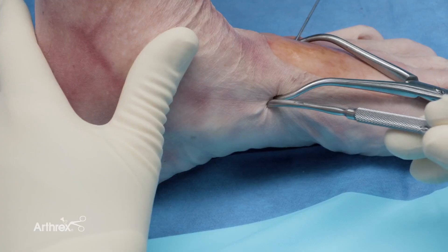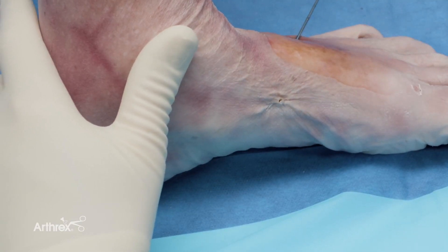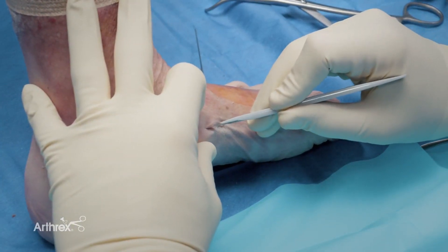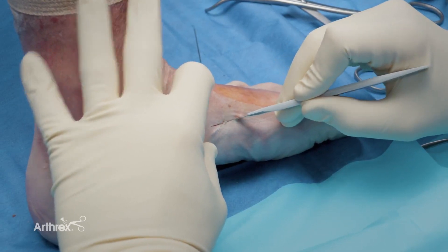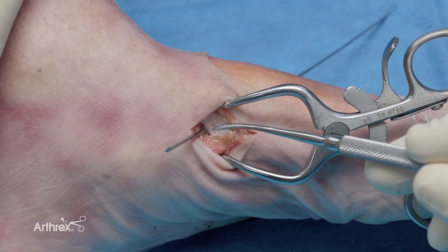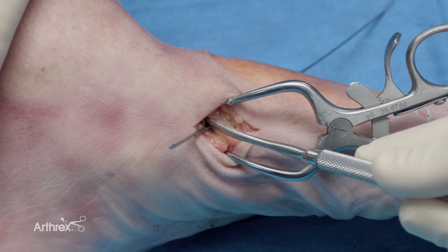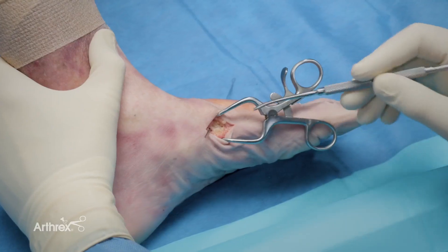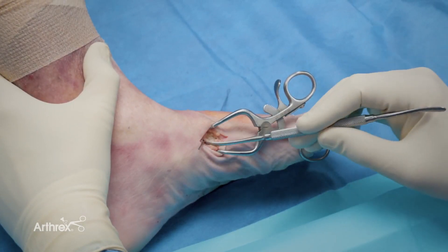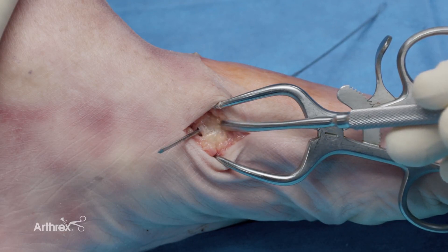To have the best soft tissue dissection and avoid any post-operative irritation, I remove the clamp. I make an incision in this area, approximately two centimeters long. Once I have exposed the wire, it's important to understand the relationship of the wire and the tibialis anterior tendon. You do not want to be placing a percutaneous swivel lock through the tibialis anterior tendon. By making this small incision, you can ensure that you have avoided any potential soft tissue irritation or imbrication. This wire is appropriately placed just proximal to the tibialis anterior tendon.